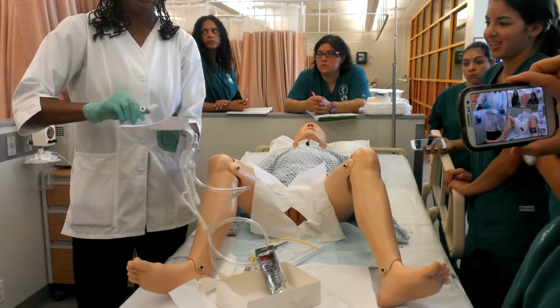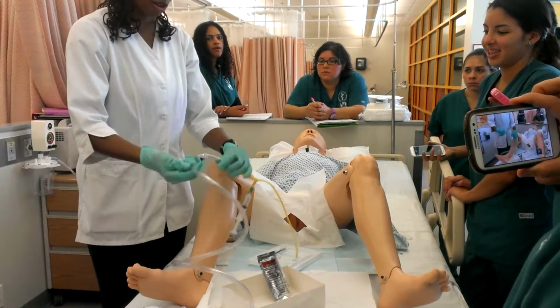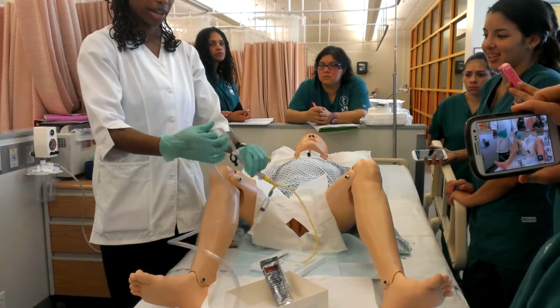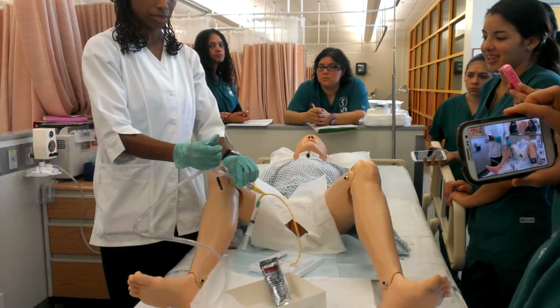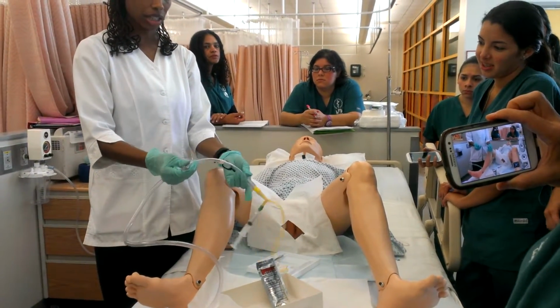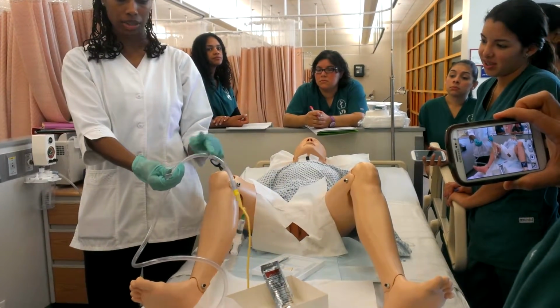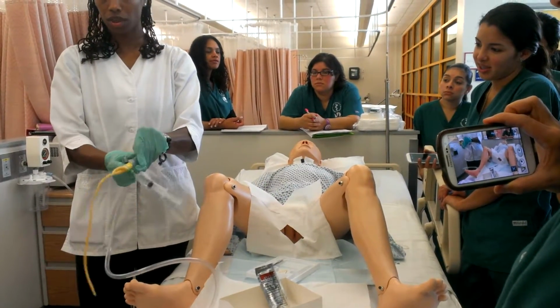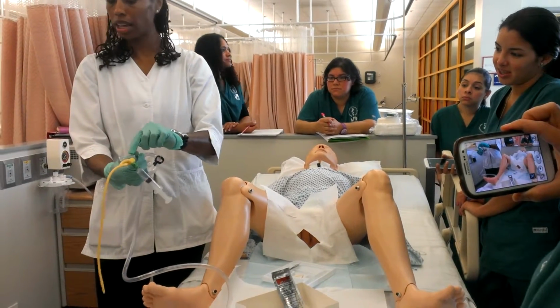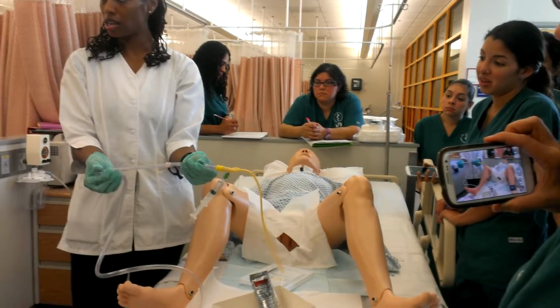What if we need to get a sterile sample after the fact? Let's say the patient already has one. Nope. What you do is you make a clamp. You can either put a clamp or you can get a rubber band, and you can actually clamp the Foley for about 15-30 minutes, and urine will just collect through here. You take a syringe with a needle, you clean that, and you draw the urine out. So this through here is sterile.